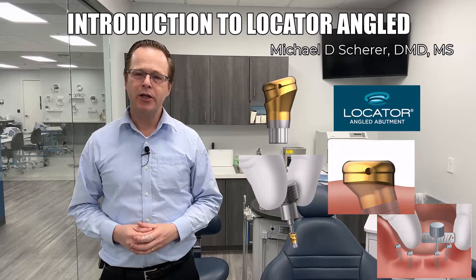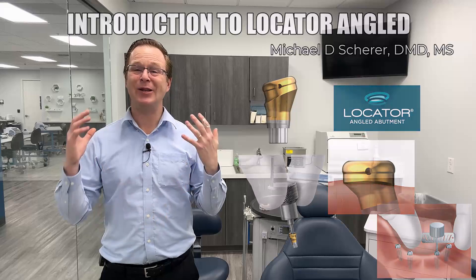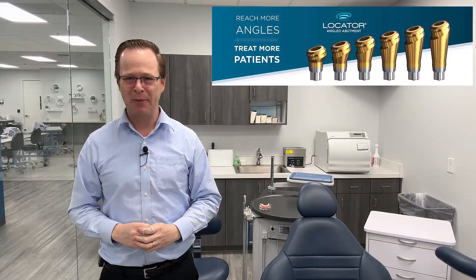Hey everybody, this is Dr. Michael Shearer coming to you from my clinical practice here in Las Vegas, talking about an incredible new update from Zest: the new locator angled abutment.